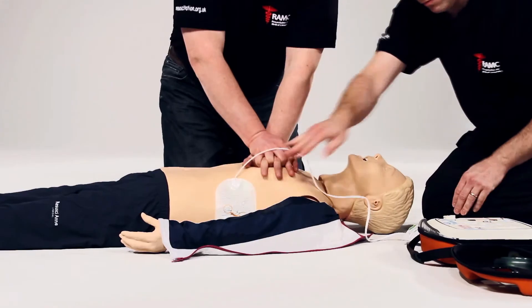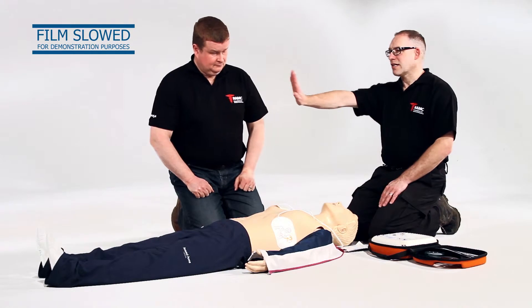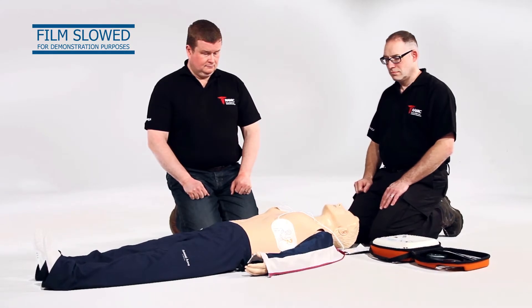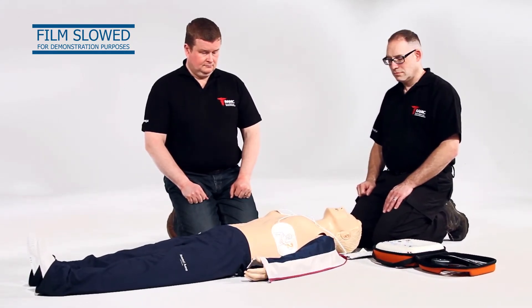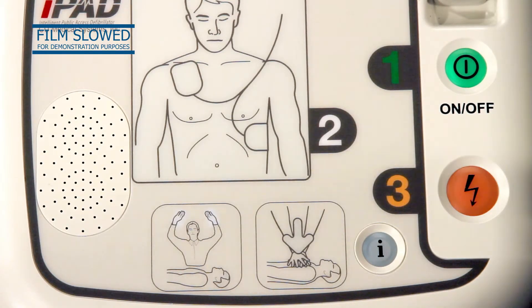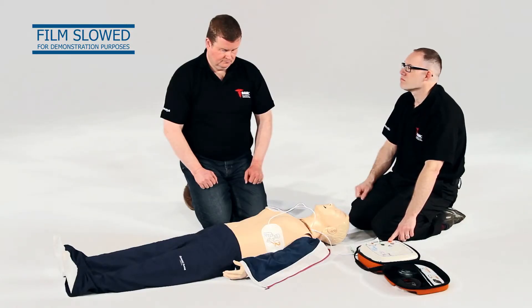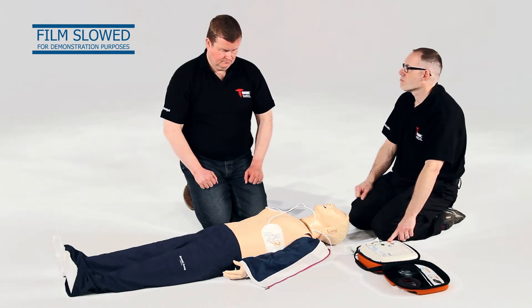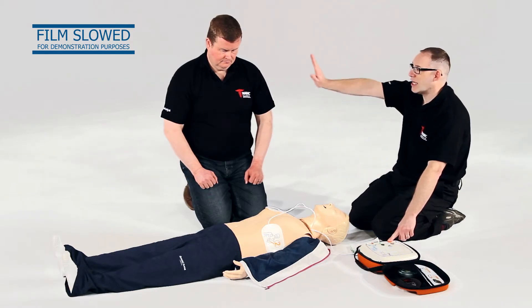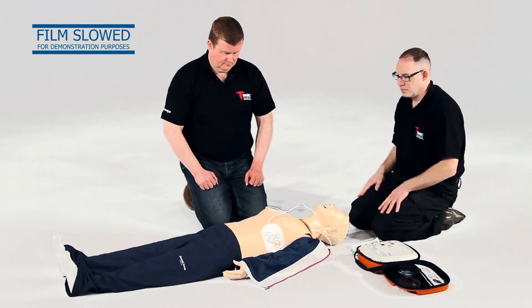Do not touch the patient while the AED is analyzing the heart rhythm. When prompted by the AED, ensure everyone is clear by prompting visually and verbally — call 'Stand clear.' When prompted, press the flashing orange shock button to deliver the shock.